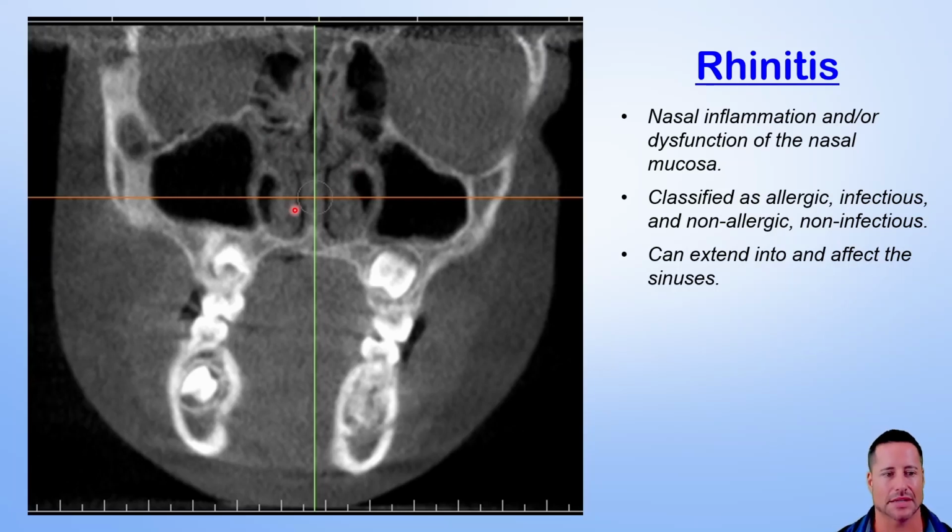And again, I'm not the diagnostician who's going to sit here and diagnose them with rhinitis. I'm reporting the finding of turbinate hypertrophy, but I certainly don't diagnose them with rhinitis or rhinosinusitis. I just let them know, and then you ask the questions: they're always stuffy, or they're always congested, or they never can breathe through their nose, or they get colds all the time. And so that just opens the discussion. Now notice this patient has a posterior crossbite, insufficient space for the tongue, so that's where it all, again, starts to tie together. And in the courses, we go into that in great detail.